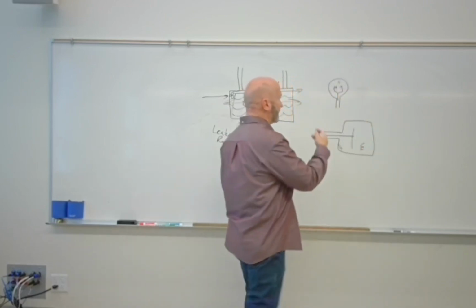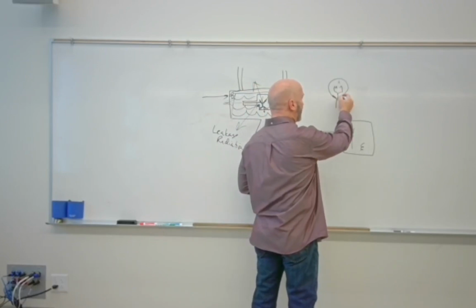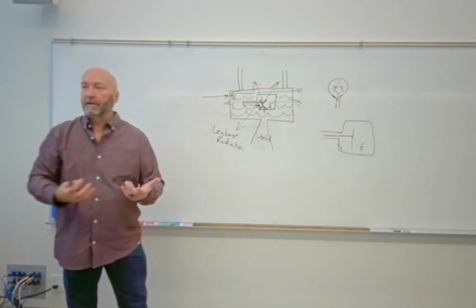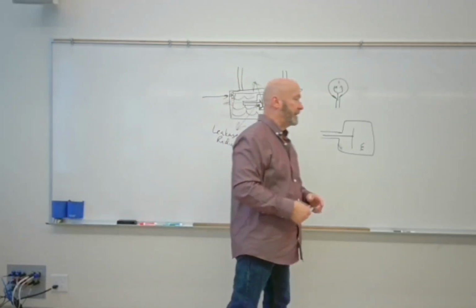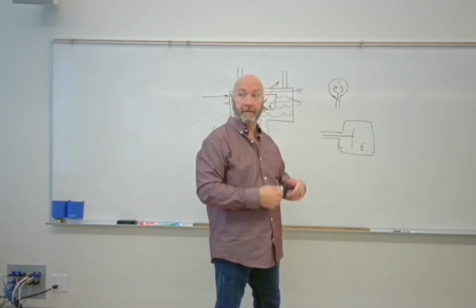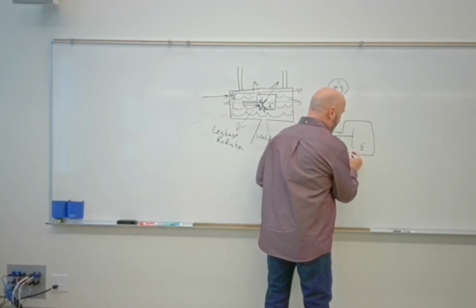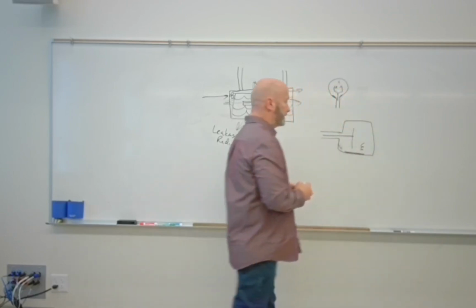Whenever you unscrew them and take a look at them, what you see is that the area right around the base of the light bulb gets dark, and that's because the filament eventually is going to melt. As it melts, it coats the inside of the light bulb. And the same thing happens with the X-ray tube. That's eventually going to melt and eventually will burn out. But as it melts, what we'll get is a layer of metal on the inside of the glass.